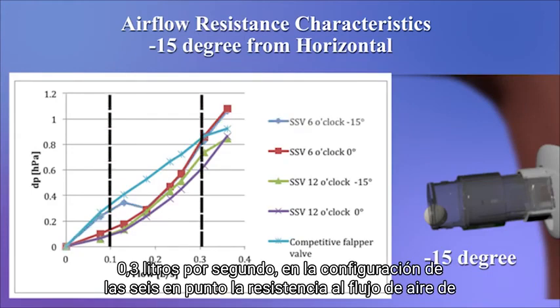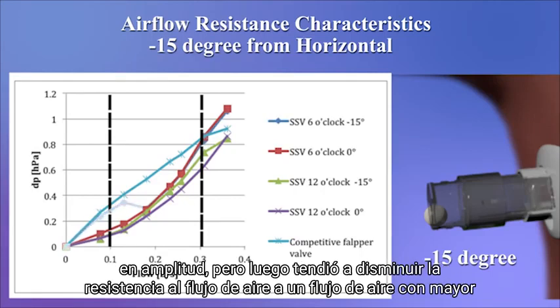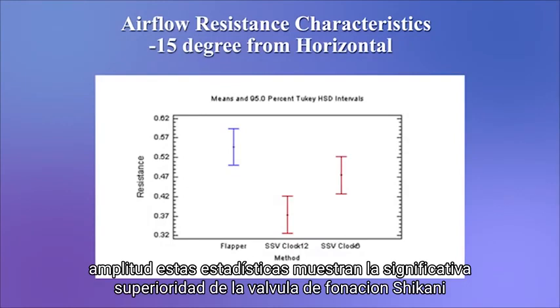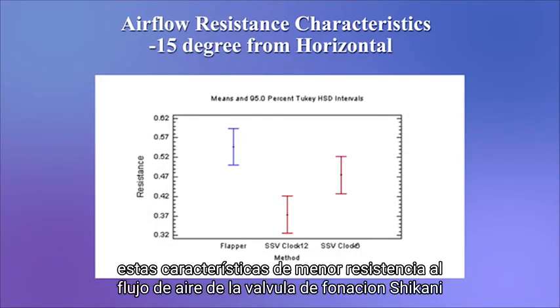In the 6 o'clock configuration, the airflow resistance of the ball valve approached that of the flapper valve at lower airflow amplitudes, but then trended to decrease airflow resistance at higher airflow amplitudes. The statistical significance of the superiority of the Shikani speaking valve was confirmed across the board using an analysis of variance, or ANOVA.